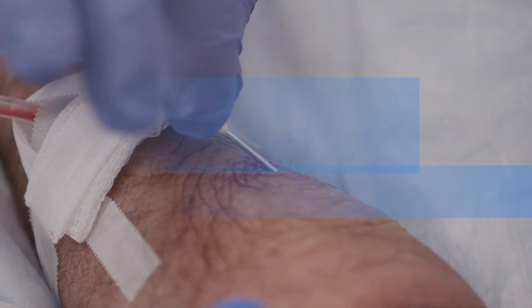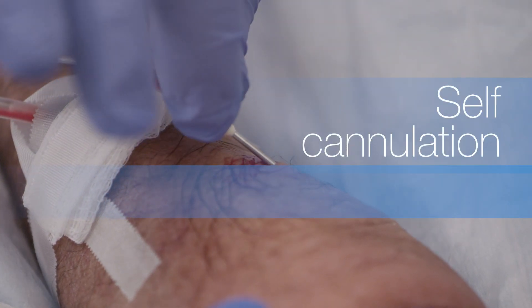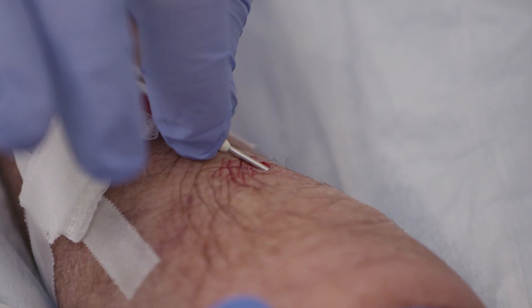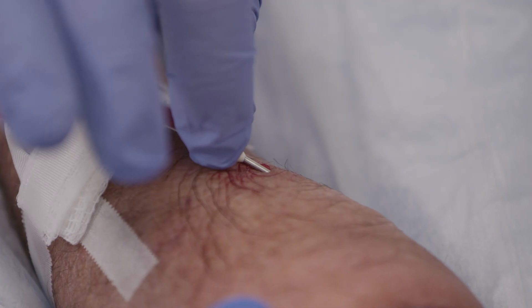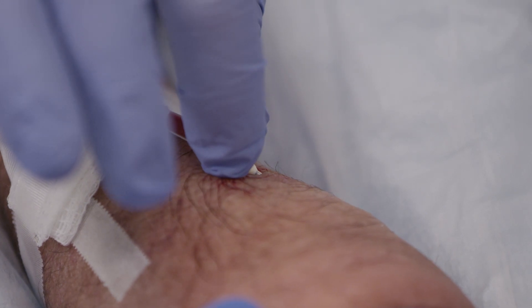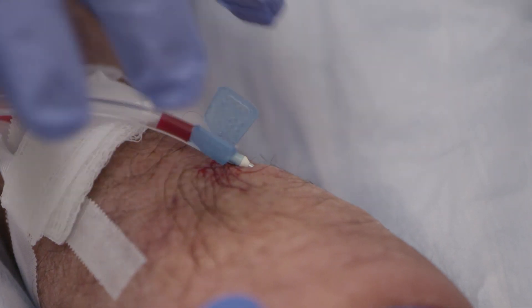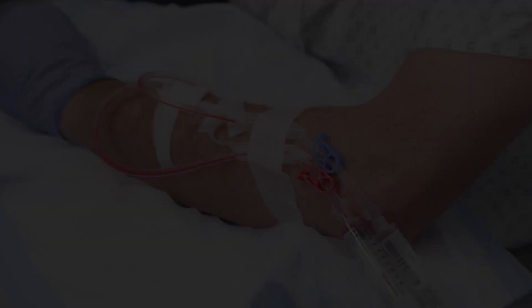Self-cannulation enables patient independence. For patients who are interested in self-cannulation, make sure to introduce the concept slowly, taking note of the patient's fear and anxiety levels. One of the biggest fears for many patients is needle insertion. It is also important to communicate proper technique to help patients understand how to prevent infections and maintain long-term health of their access sites.